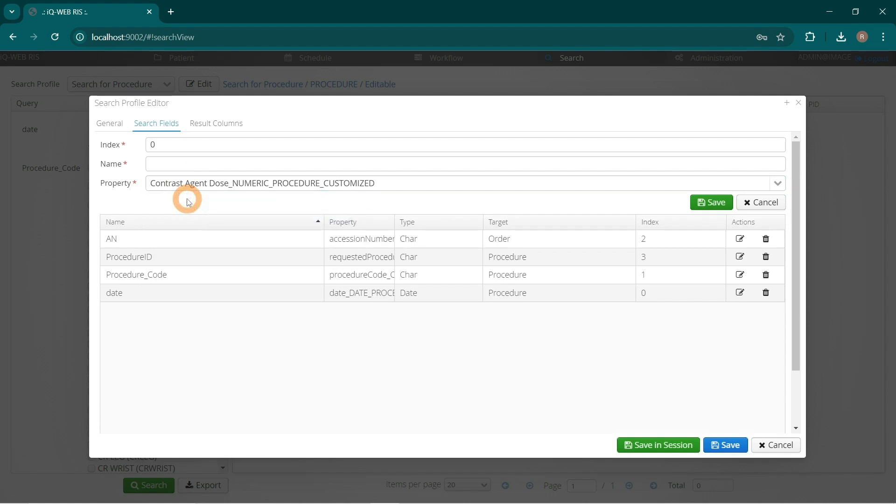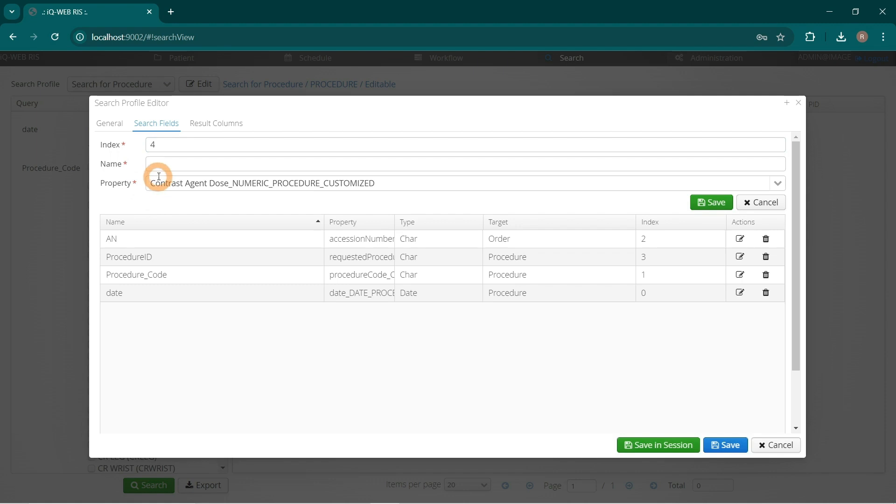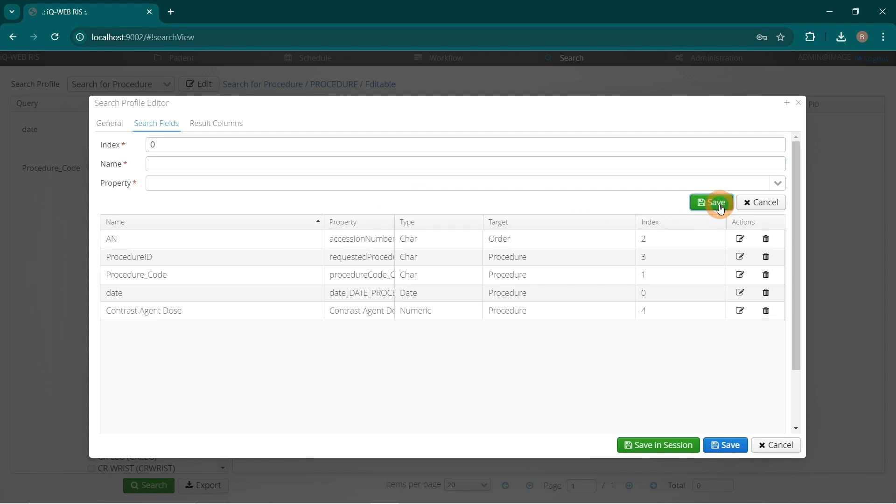Define index as 4 and name as Contrast Agent Dose. Click the green Save button. A new row Contrast Agent Dose is added in the Search Fields table.